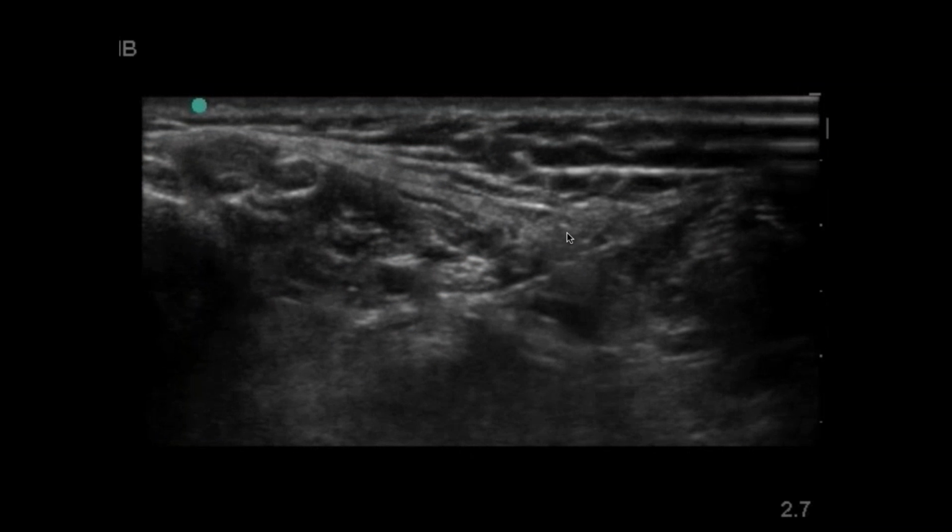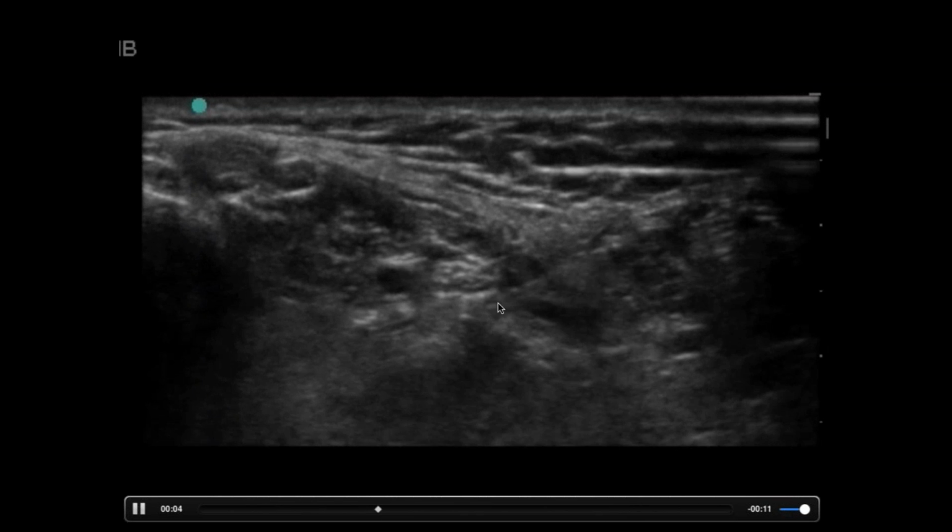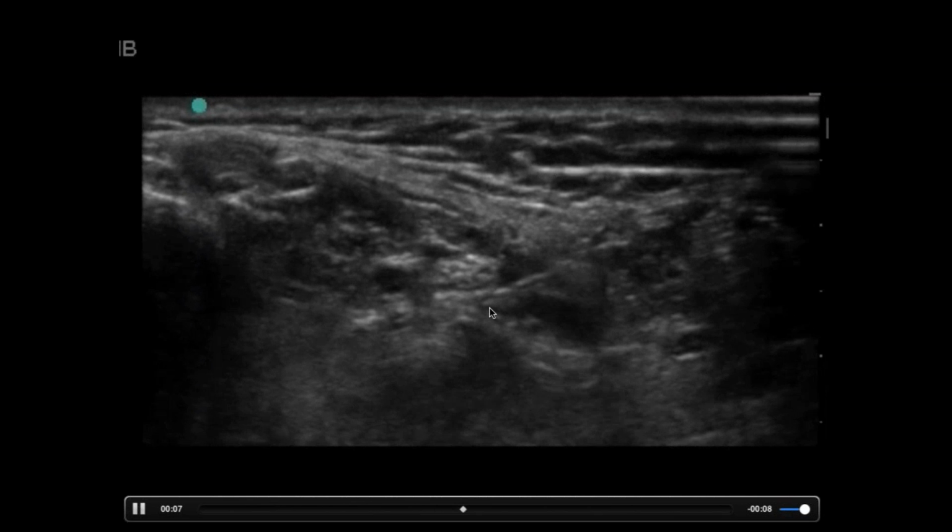Here's a video demonstrating artery, nerve, needle tip, and infusion of anesthetic.